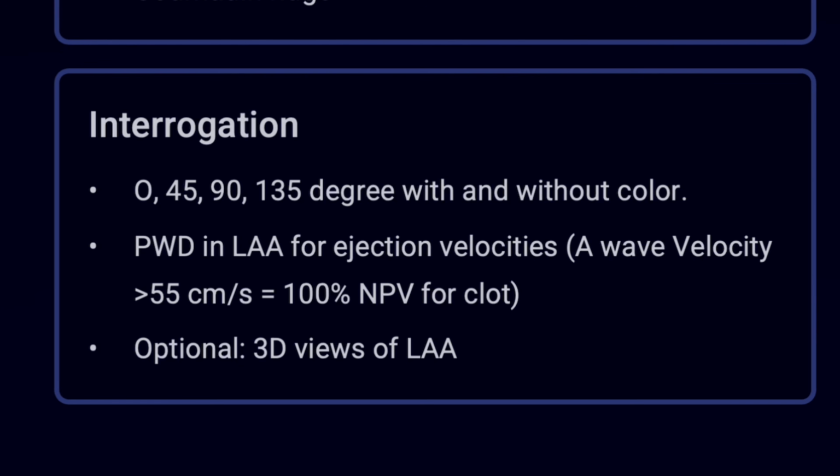Using multiple views is helpful because one specific view may miss an extension or alternative lobe of the left atrial appendage that you cannot see with another one.